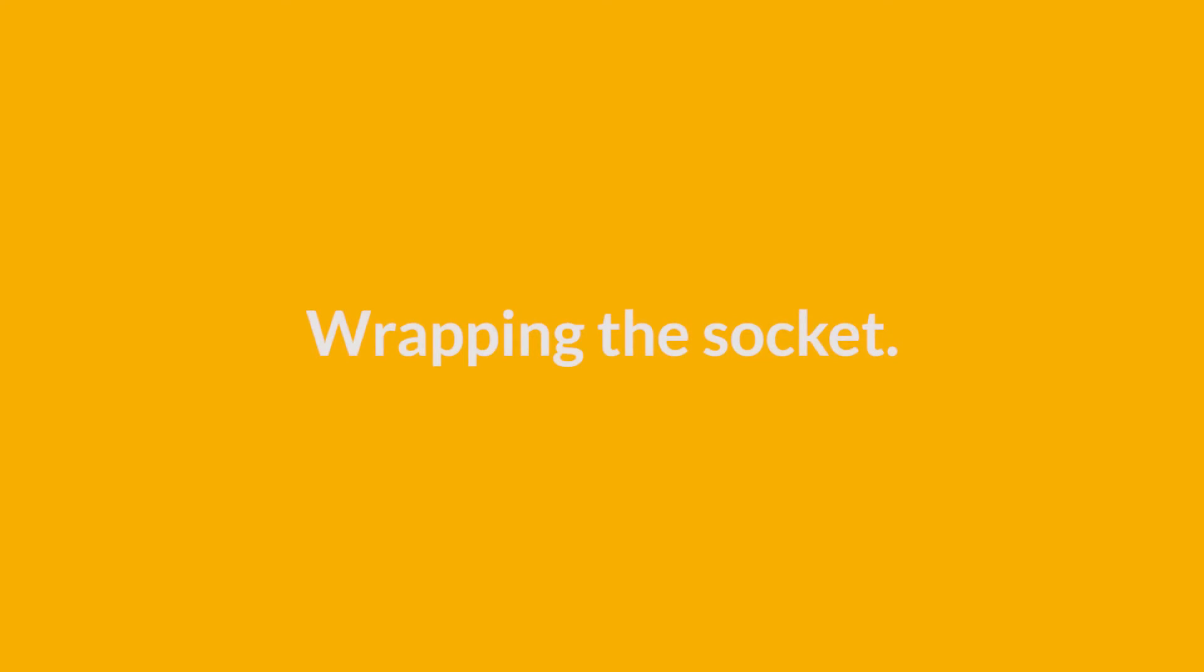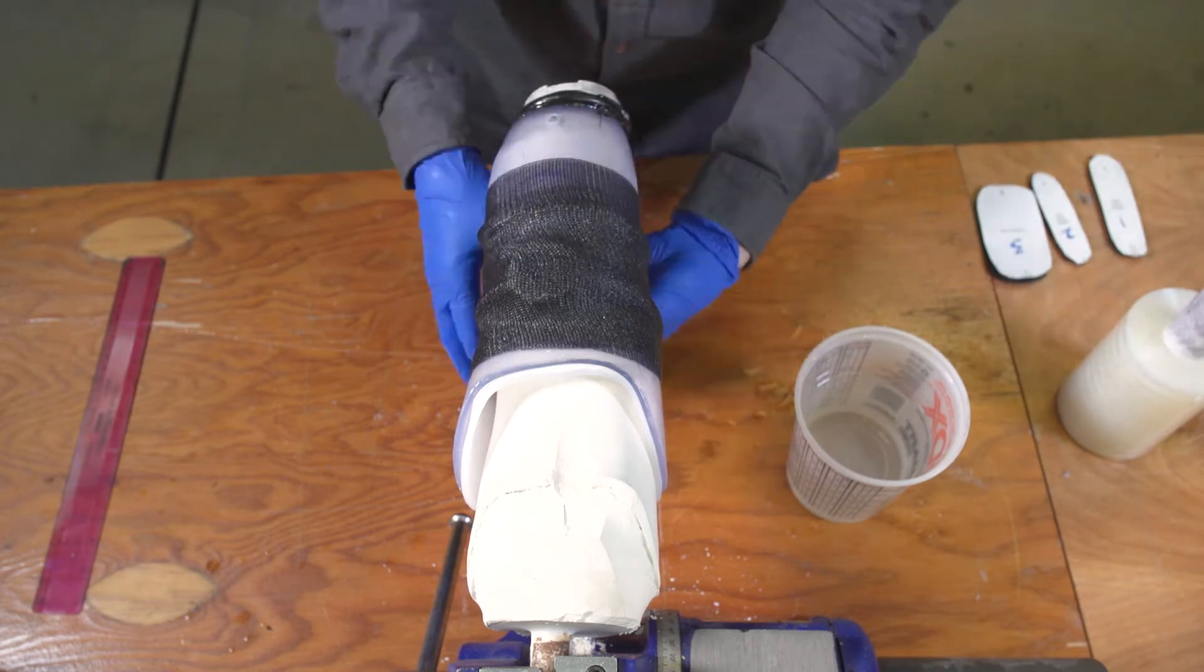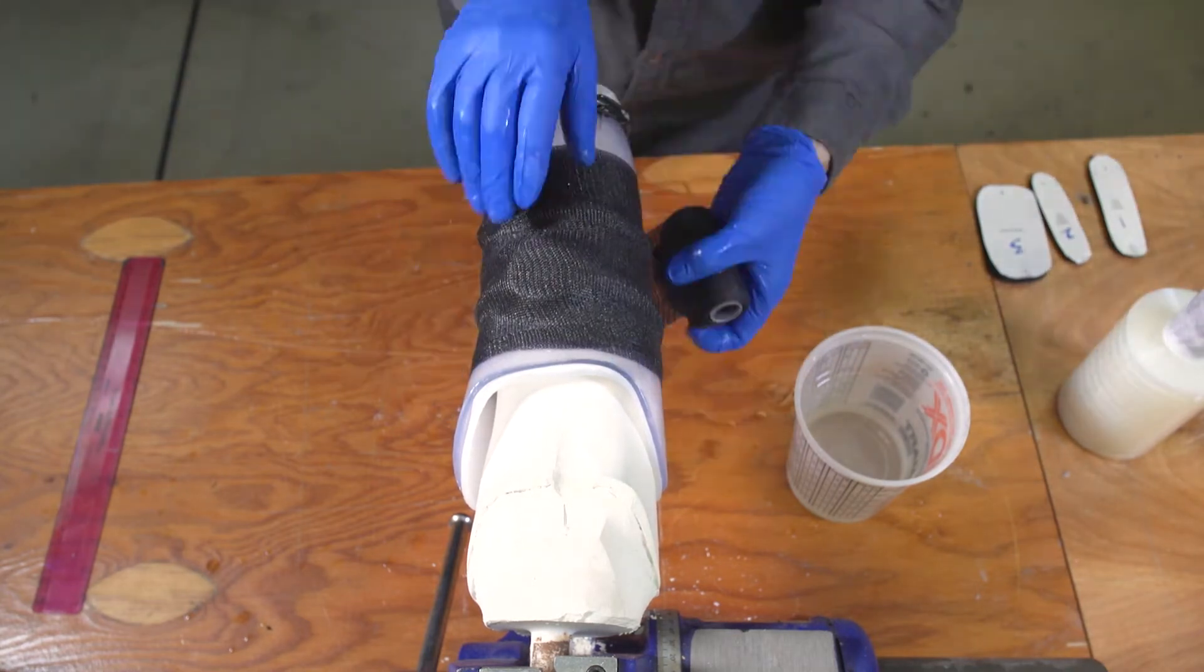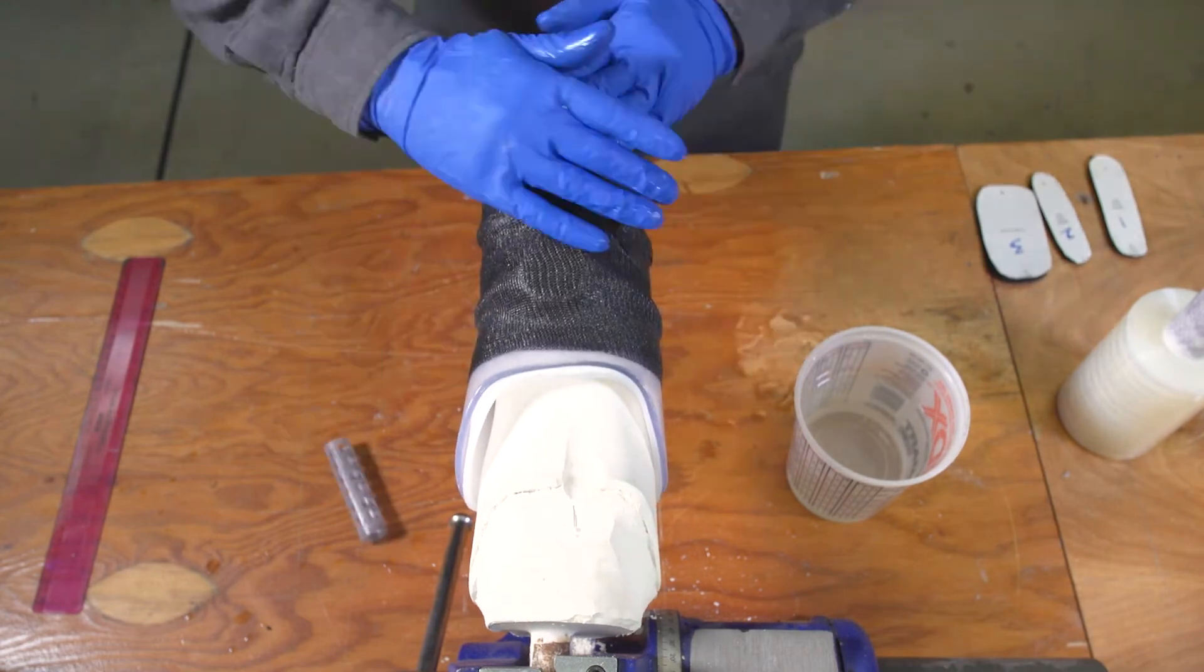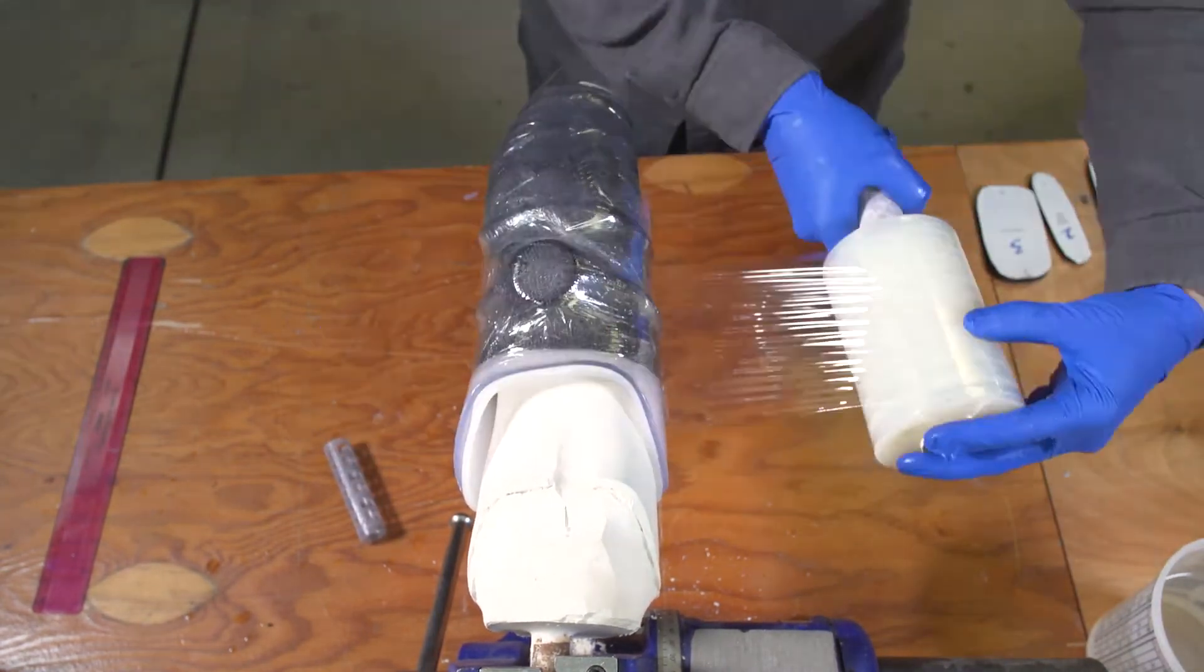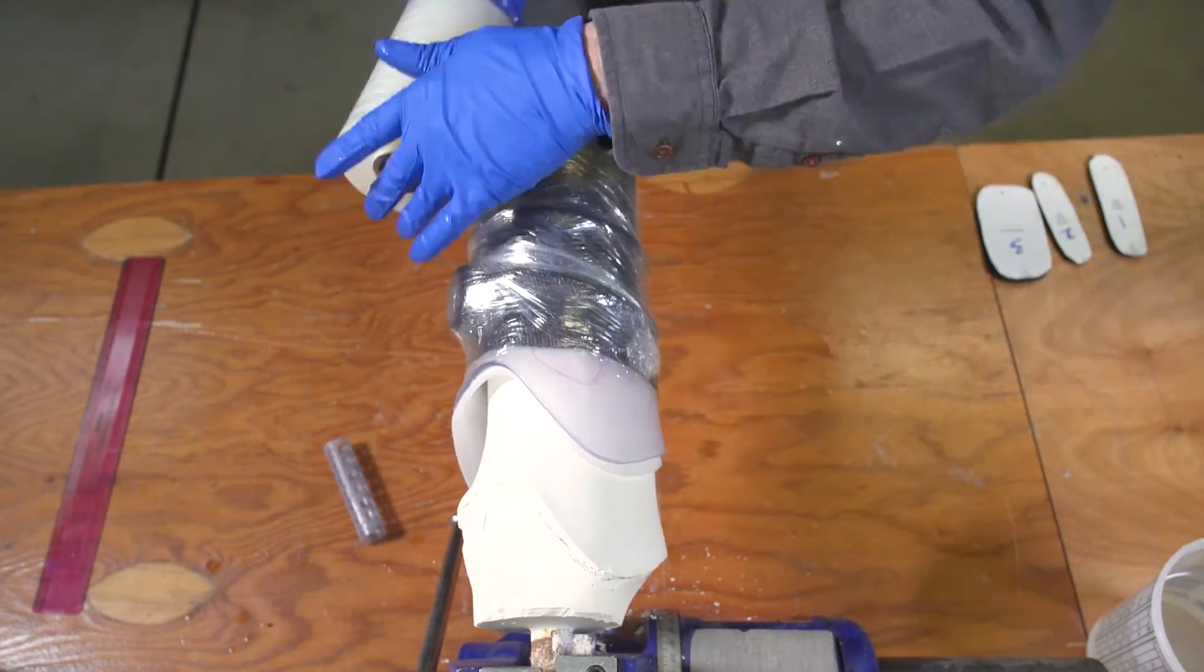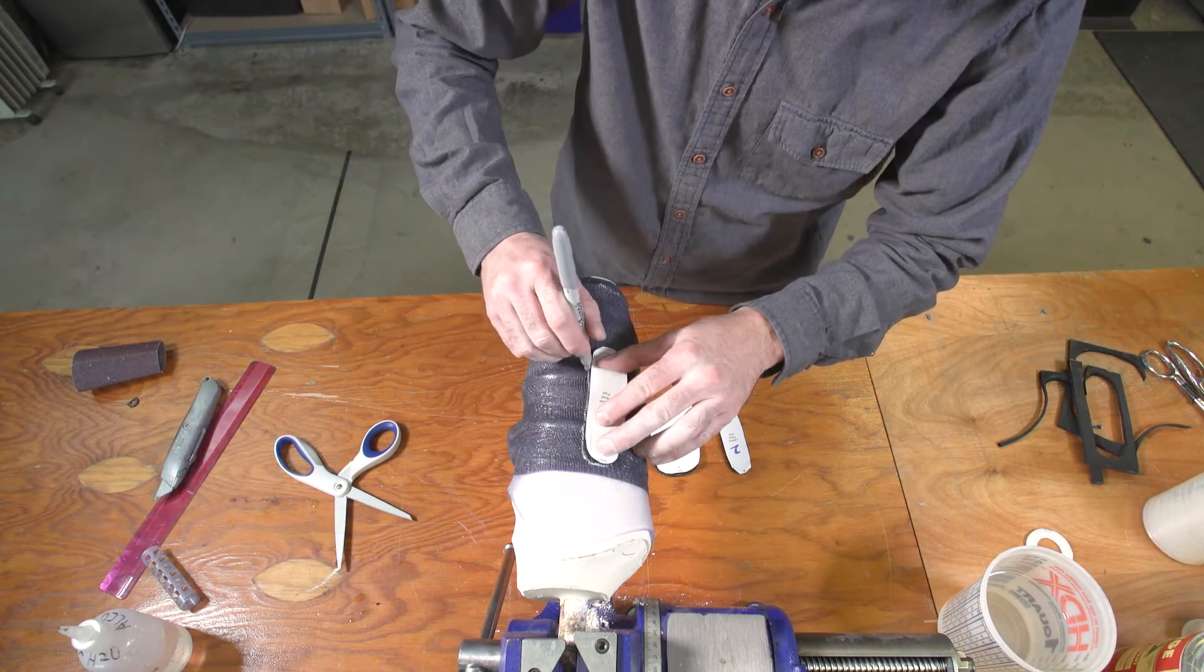Wrapping the socket. Now, wrap the whole thing, socket, tubing, and dial base, in two layers of fiberglass casting tape. Then, to make sure the fiberglass fully bonds, tightly wrap the whole thing in clear plastic wrap. Once the fiberglass has set, about two minutes, remove the plastic and re-mark your panel locations on the socket.